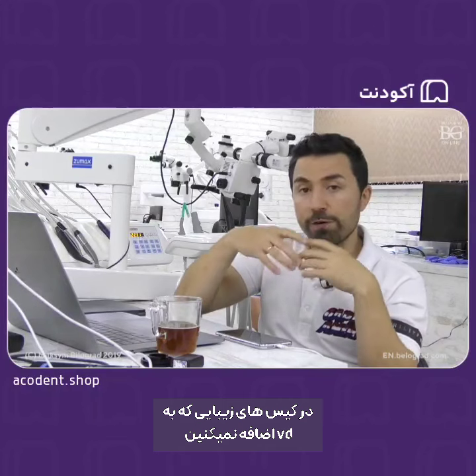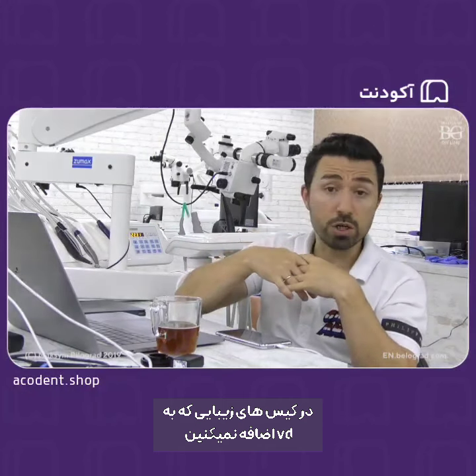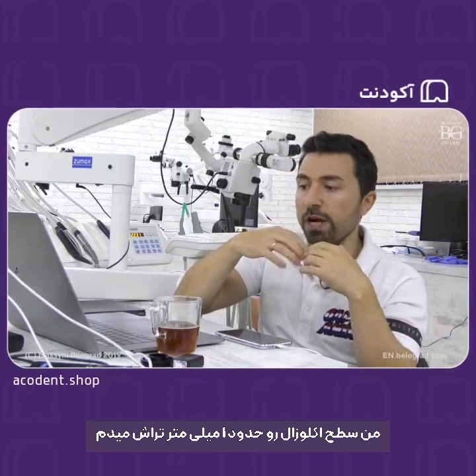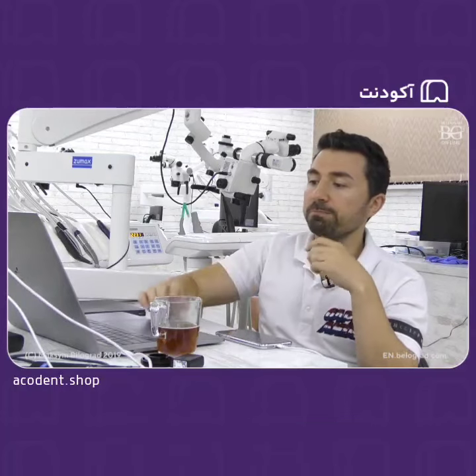So in case of aesthetic rehab, when you don't do any increase of vertical dimension, so basically you're not adding anything, I do preparation on the occlusal surface of about 1 millimeter. Okay, about 1 millimeter.